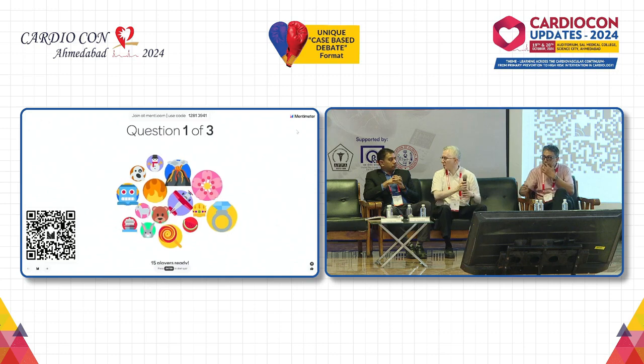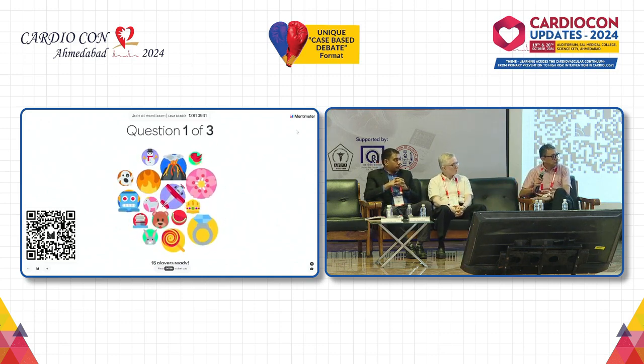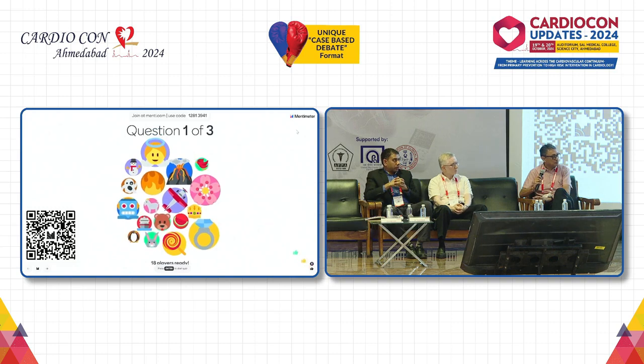Many times you have larger diameter vessels. In that case, rotational atherectomy would use 2 burrs, 1.5, sometimes 1.75, or 1.25 to start with, while orbital has only one size crown. We can also have bidirectional use. So that is the advantage of using orbital in a larger diameter, heavily calcified vessel.